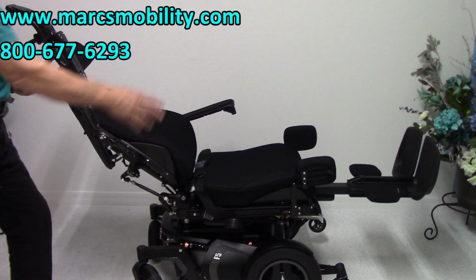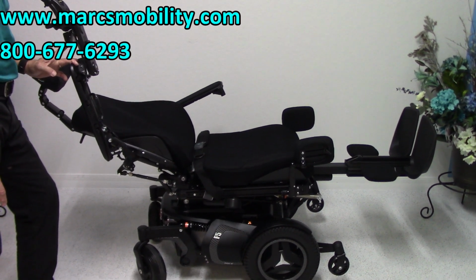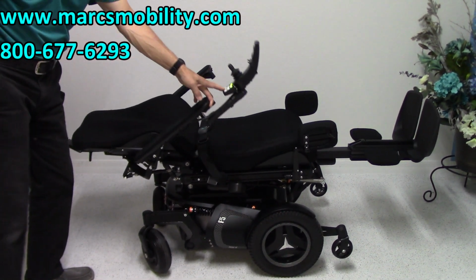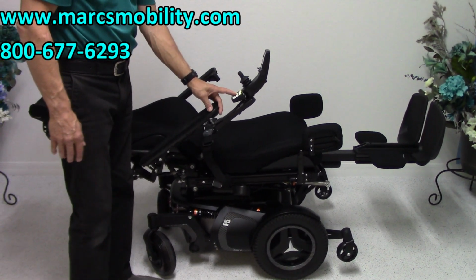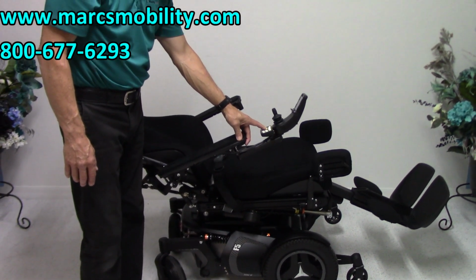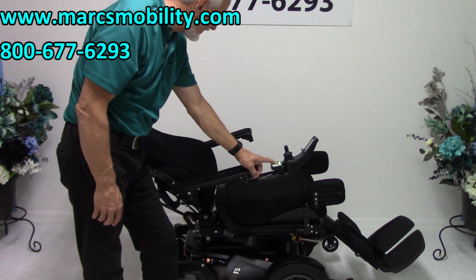And this chair has a lot of custom stuff on. I'll show you in a few minutes what else it's got that's custom on this chair. So it's a full electric recline. Okay, so if you were laying in your chair, this is what it would look like laying down flat. That's the electric recline there. So now I'm bringing the back and the legs at the same time.